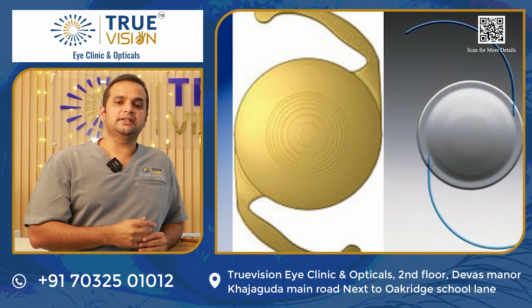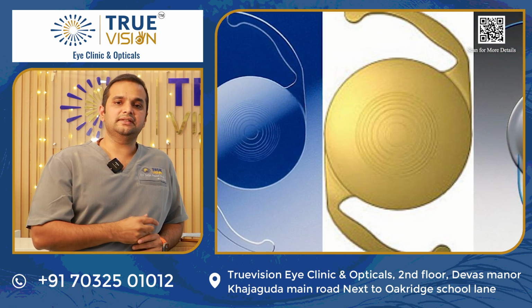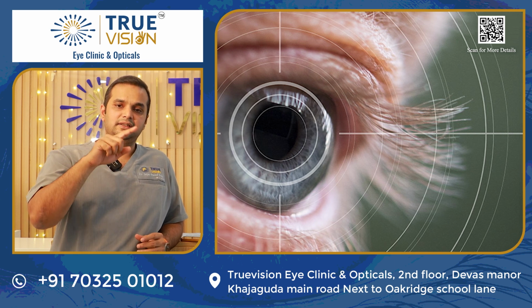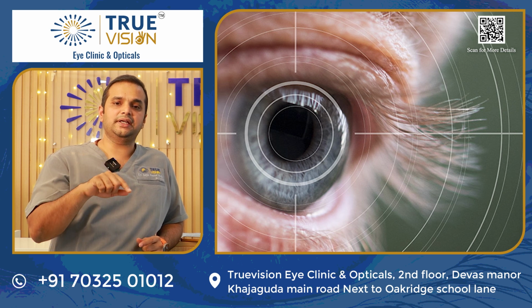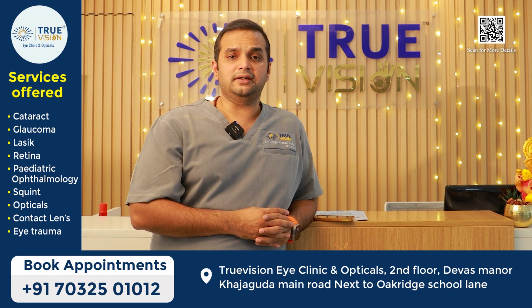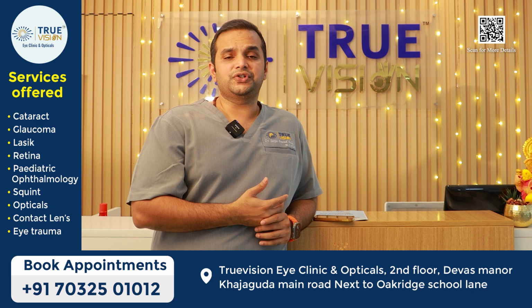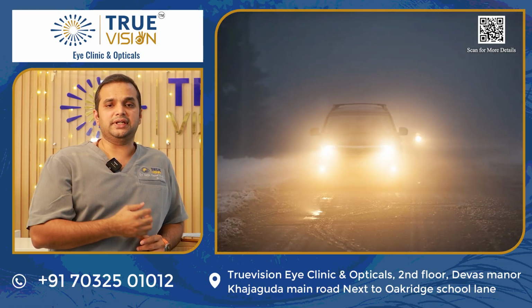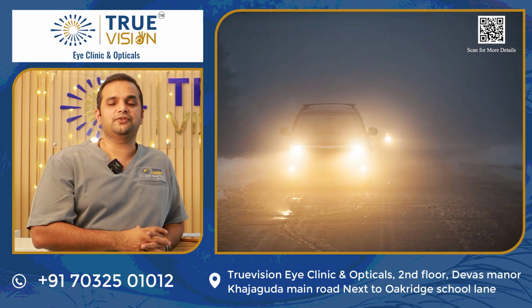One disclaimer here, or the side effect you might have with the multifocal lens, is that because this lens has both your visions in one lens, it has them in the form of multiple rings. So your distant and near vision are imparted into the lens in the form of rings. Whenever you are driving, on very few occasions, maybe when there are no street lights, and at one particular angle, when light hits this particular ring, you might have a glare, that too for probably a fraction of a second.